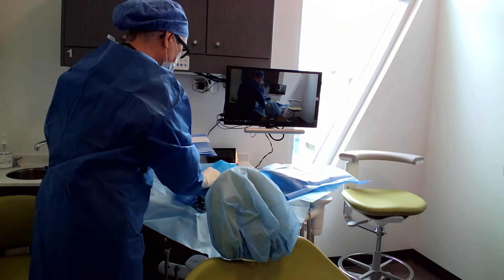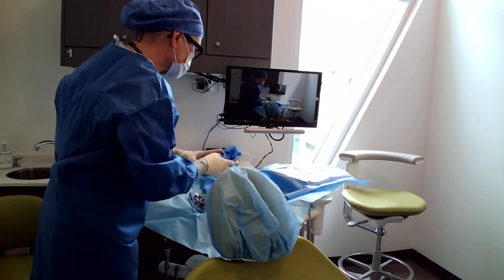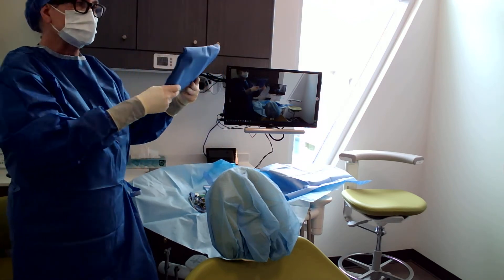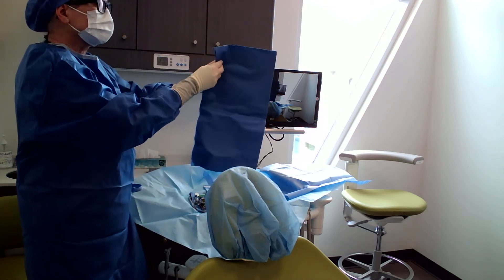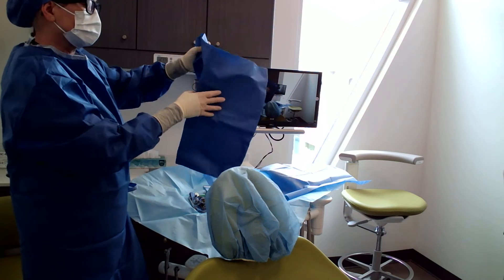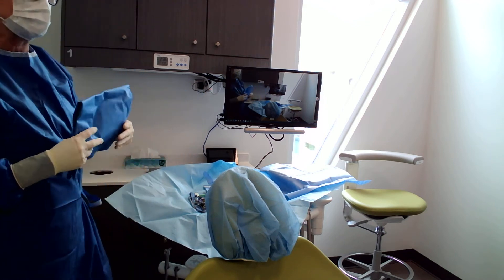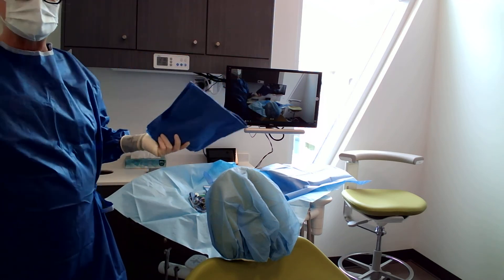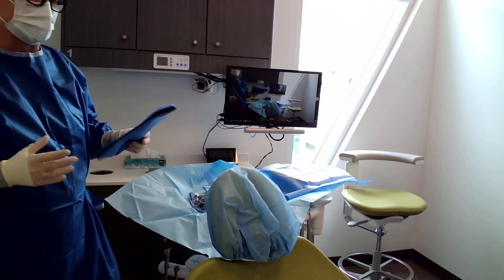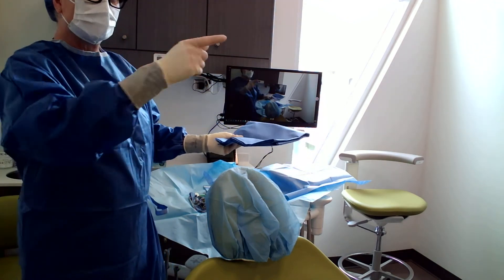I have an extra one, so I'm going to put it here just in case. I'm going to put my patient drape here because I'm going to use it for something else. This is a patient drape for a normal clean surgery — it's not that big. You'd use it for wisdom teeth, a biopsy, or a standard extraction. But I want to use a bigger one today to make sure the patient is completely covered and sterile, with no risk of contamination, because we don't want her to get an infection in her bone.